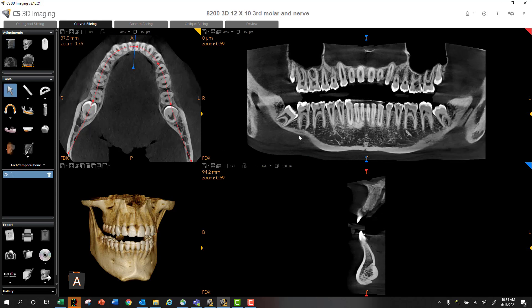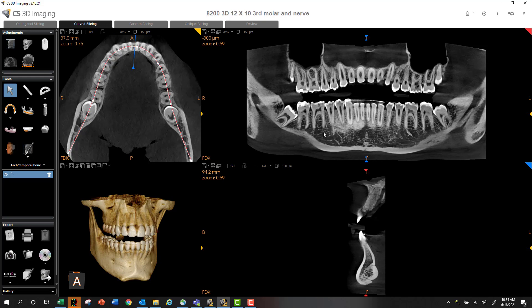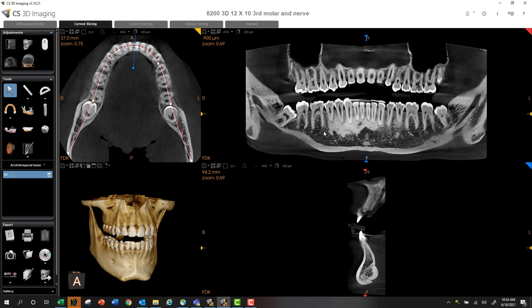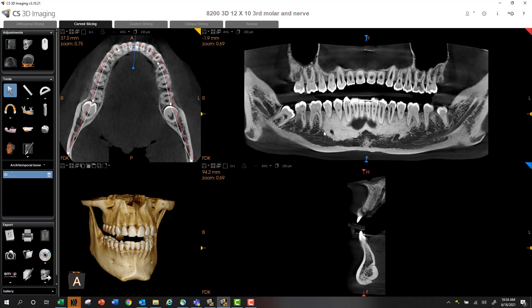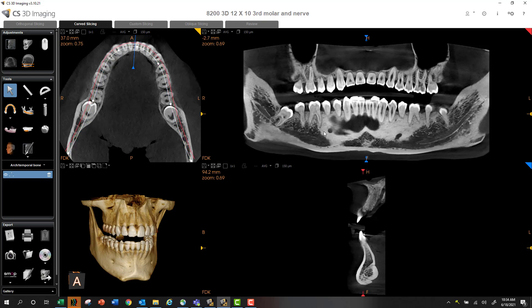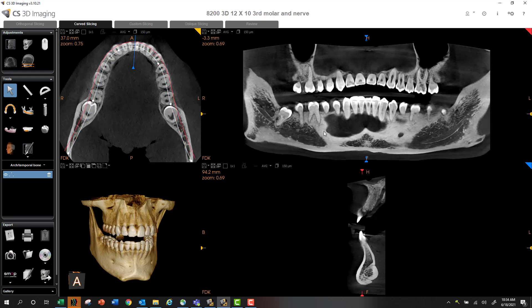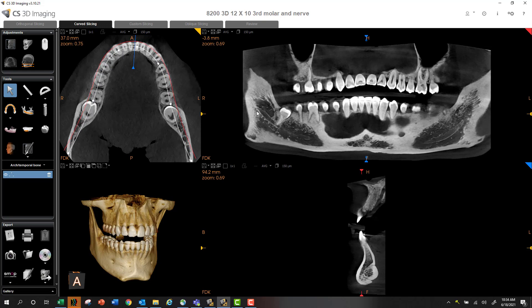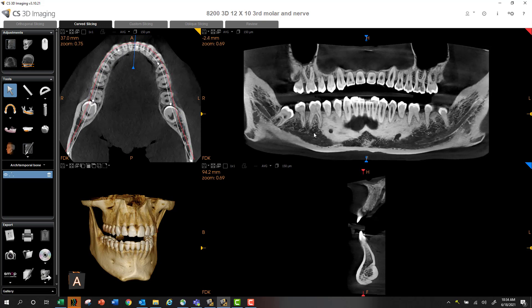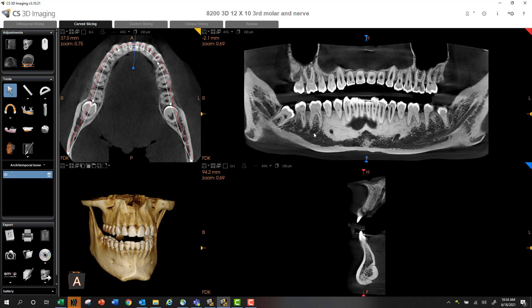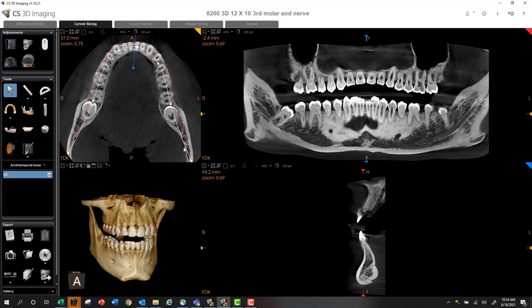And then when we go to map our nerve canal, we would slice through buccal lingually so the nerve jumps out at you as you scroll. You would scroll and mark, scroll and mark, and so on. It's a great technique—it works really well—but there's an alternate method that I'm going to show you.